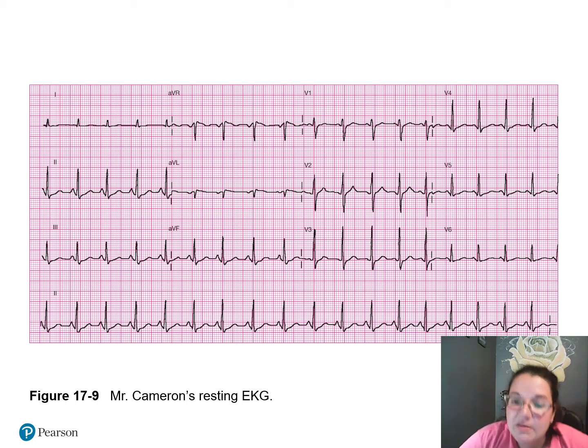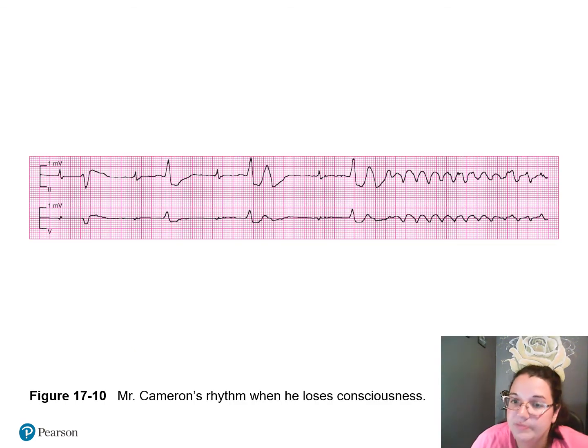This is Mr. Cameron's resting EKG. Right, looks pretty normal. This is his event monitor when he loses consciousness. In other words, he's passed out, right? Does not look normal. I see a bit of a sawtooth going on, right? And also a fibrillation.